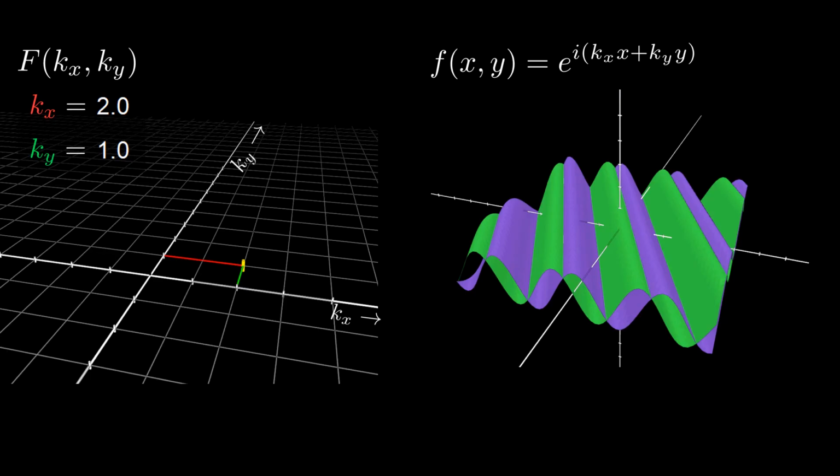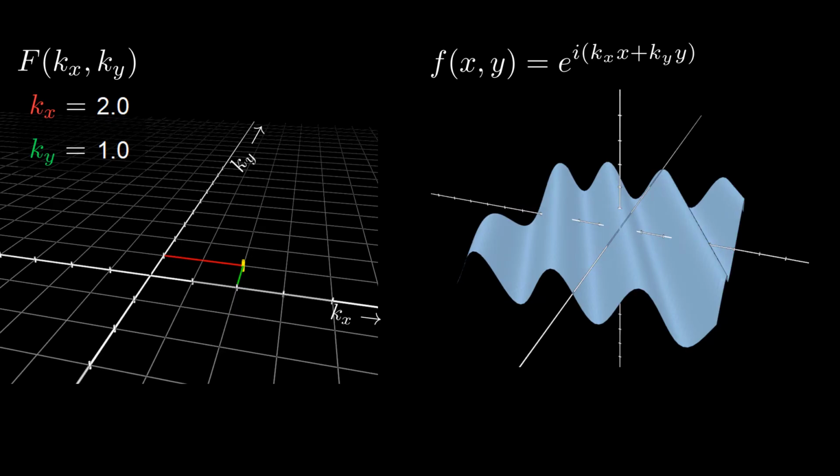You can see from this expression that the 2D function we're describing, f of x y, will increase in phase and thus sinusoidal wiggles according to the sum of phases kx x and ky y. As such, we call these individual 2D sinusoids the spatial frequencies. Low spatial frequencies have few wiggles per unit space, and high spatial frequencies have many wiggles per unit space. Just like we did with 1D sinusoids, I'm going to simplify the plots here by examining only the real part of f to start.